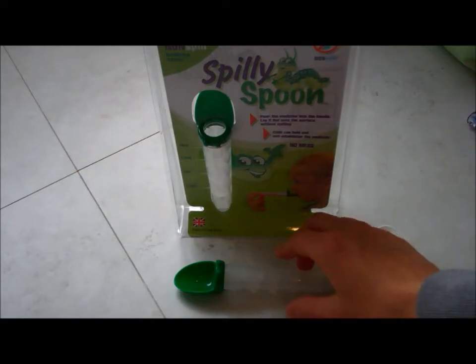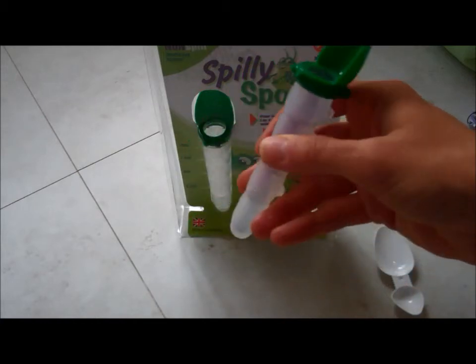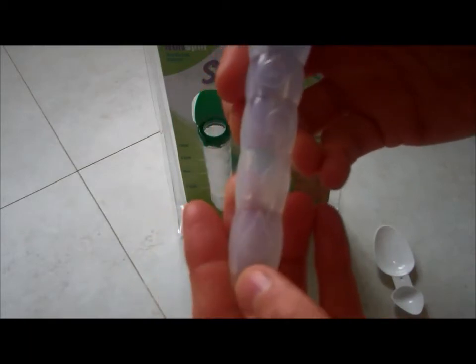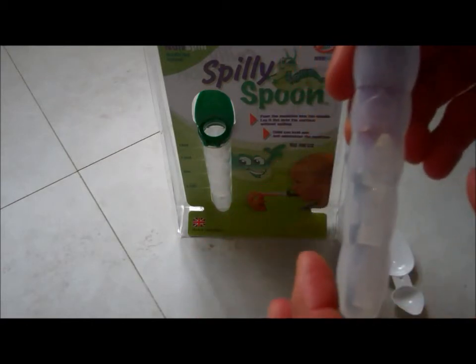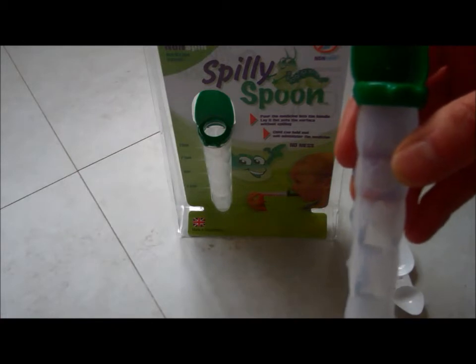This is where the Spilly Spoon absolutely solves those problems instantly for us. It's a medicine spoon but it's fully enclosed, and it has measurements on the side from 2.5, 5, 7.5, and 10 mls. The 10 mls is the larger dose, equivalent of two spoons that I sometimes have to use for our older one.